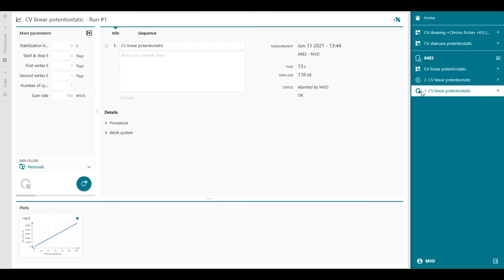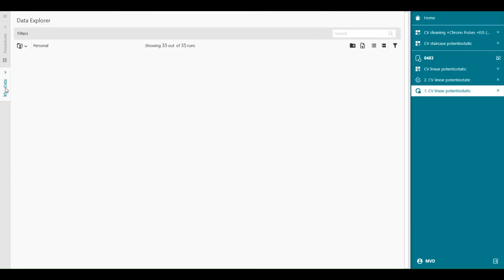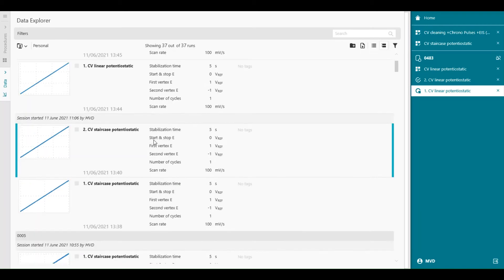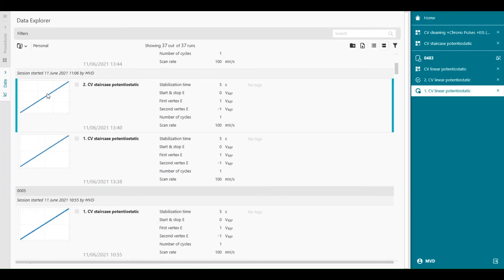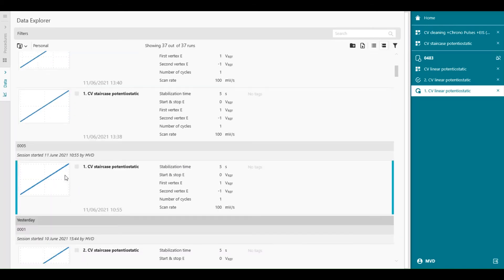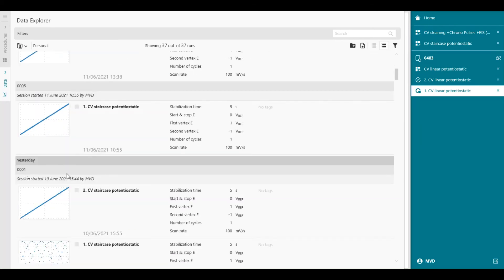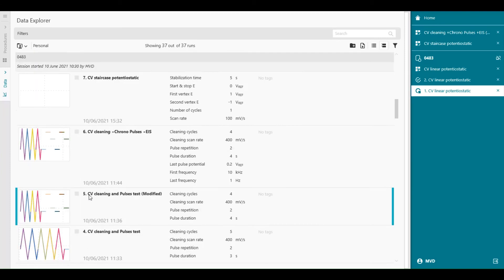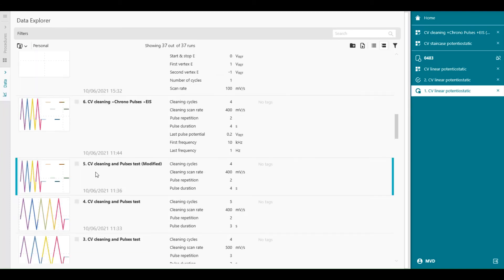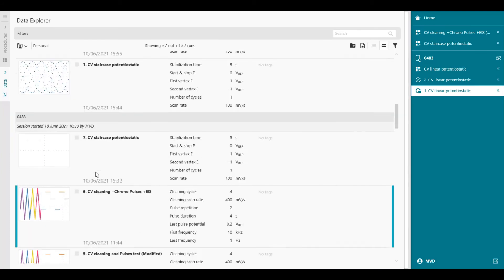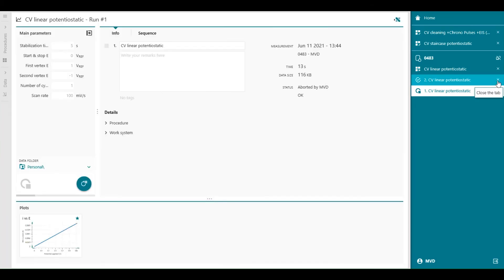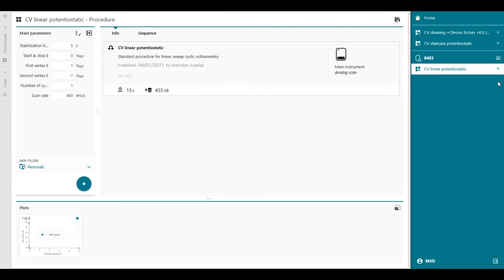The data from each run is automatically saved in the database. So you go to the data, and here you will find the runs and the sessions. So you can find different sessions with different instruments and different data. So when you close this, you can always find the data back in the database, and it can be reopened from the Data Explorer.